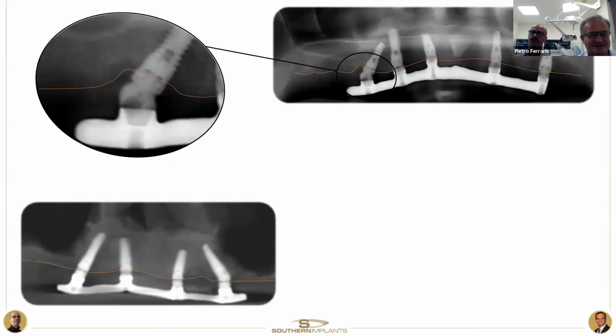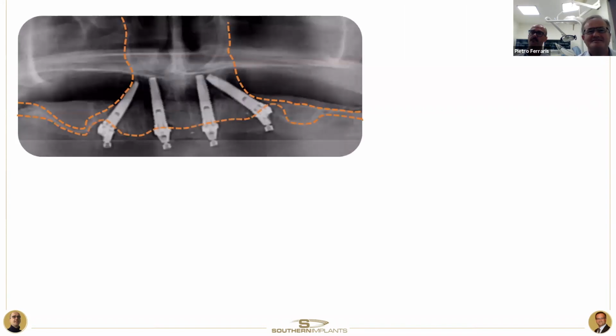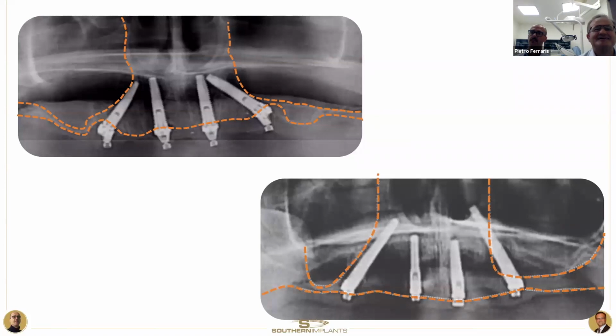When we take a look at a radiograph in which we have used angled implant, coaxis, placing a multi-unit abutment that is straight, we have the same bone remodeling, but the bone remodeling is directed on the plate, on the shape of the bone. So we have a different situation. And this slide summarizes the two aspects: using straight implant with angled multi-unit abutment or angled implant with straight abutment. The different pattern of bone remodeling are quite clear, I think, and this could be the starting of issues for sinus inflammatory disease, when we have a lack of sealing, talking about soft tissues and hard tissues, in that situation.